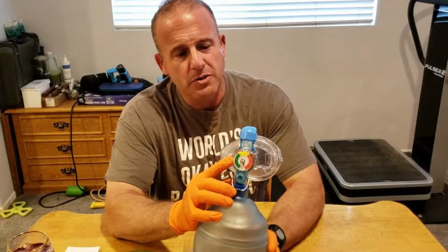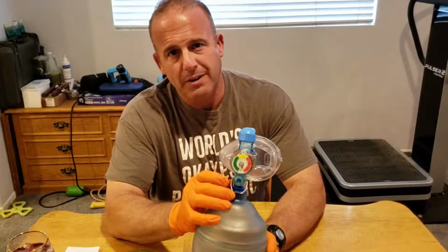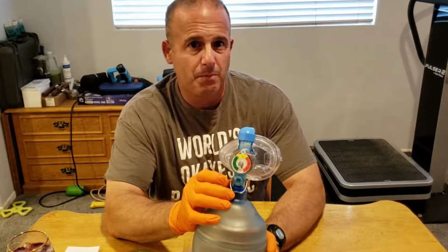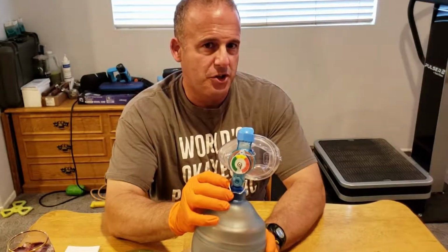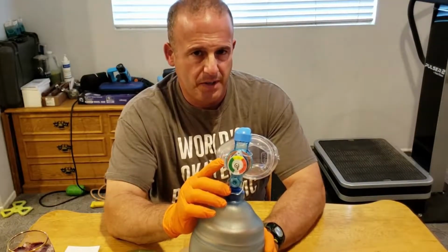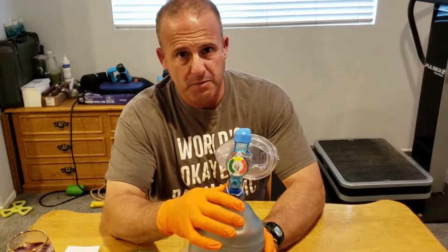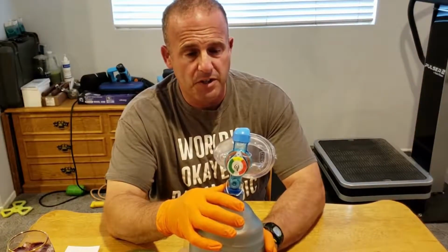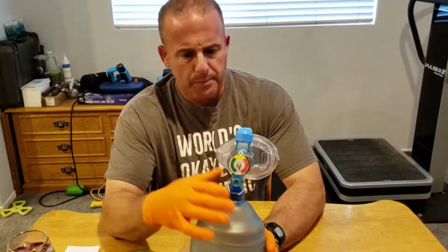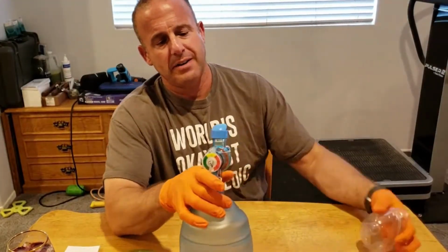It was purposely chosen because it resembled the tachometer on a car, with a green for safe, yellow for caution, red for danger zone. Anything above green becomes now indicative of either an airway obstruction, in other words, fix it, reposition, suction, whatever you need to do, or you are squeezing the bag too hard. So let's go down how this works first.